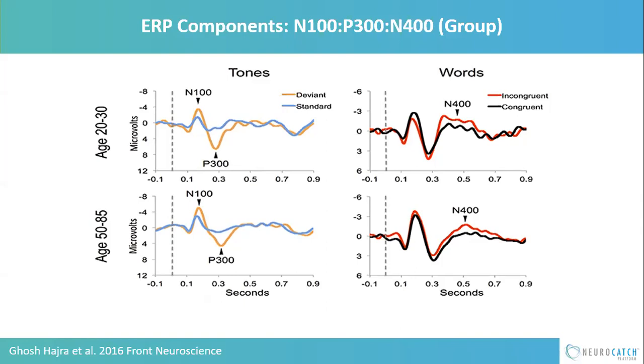Now, if you go forward from the 0 point in time, ahead of the N100, you'll notice there's actually a little dip. Now, how do we name these things? I mentioned this on the onboarding training, but basically, if it's a negative going peak around 100 milliseconds, doesn't have to be exact, then it gets the name N100. So ahead of the N100, you see this small positive going peak, which also occurs around 100, and that's called the P1. So there's this complex for any stimulus that shows the P1, N1, and then often the P2 and then P3.